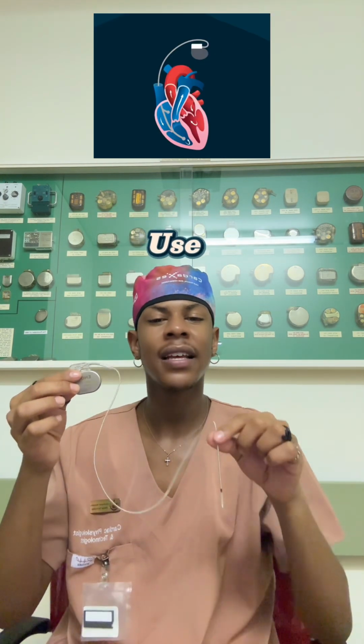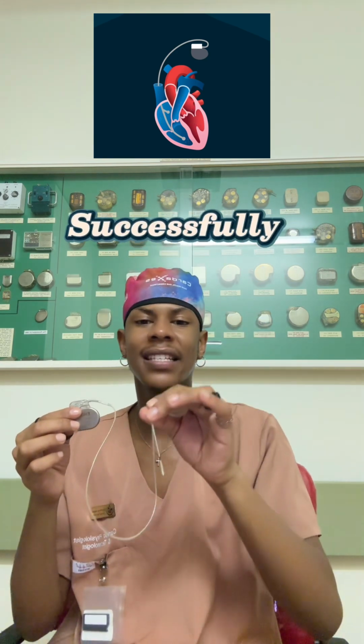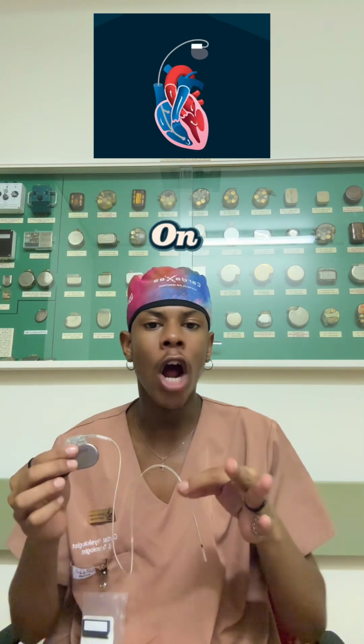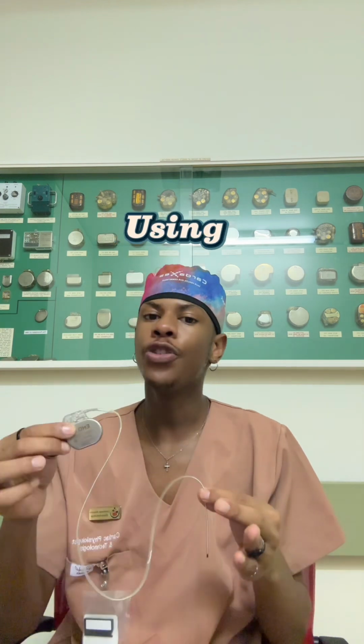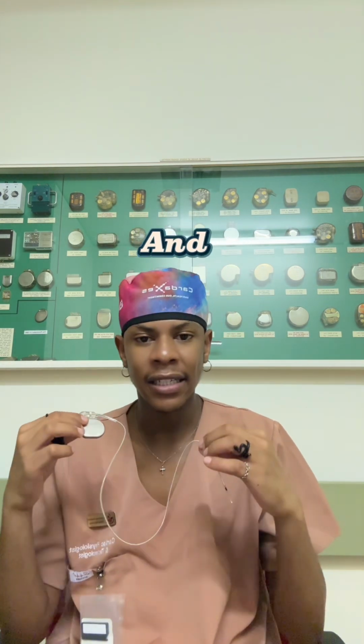We usually use the left axillary vein. Some use the subclavian vein. It just depends on the hospital. After the lead has been successfully threaded to the atria or ventricle, depending on the area that needs pacing in that patient's heart, we then program this device using a programmer, which is like a machine. We tell it that we want it to contract at this rate, and we also want it to record episodes.